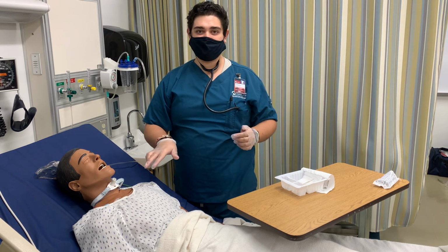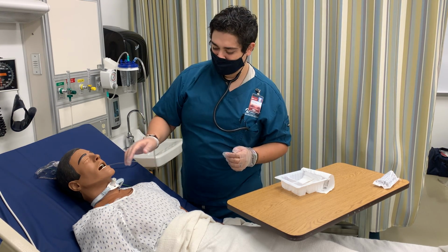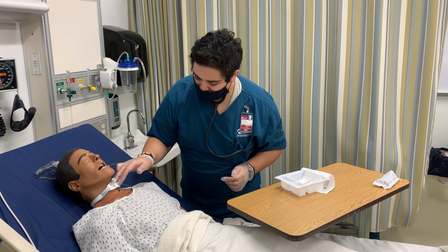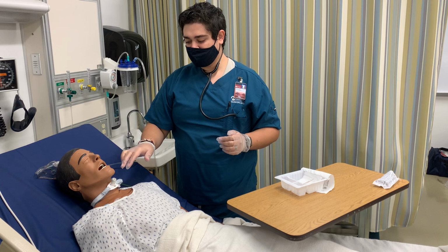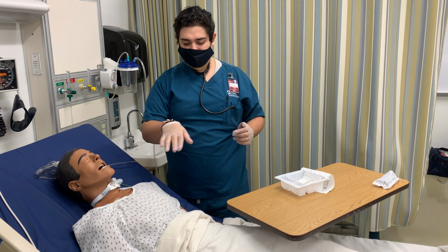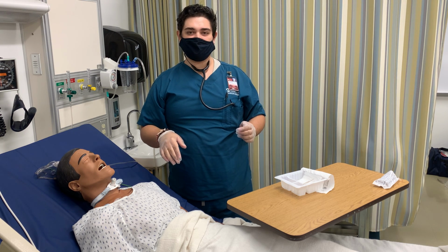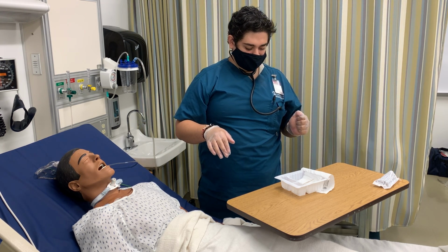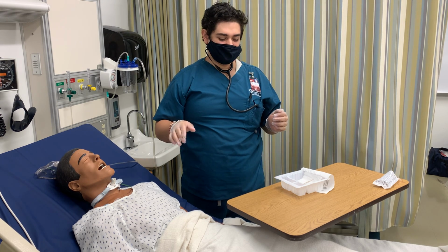I will be assessing his stoma and peristoma areas, which are pink and moist, and no signs of infection. Making sure that my patient is also without signs of hypoxemia.